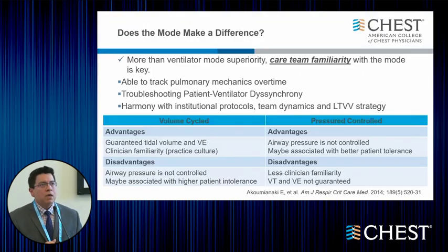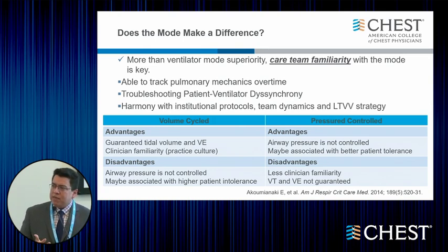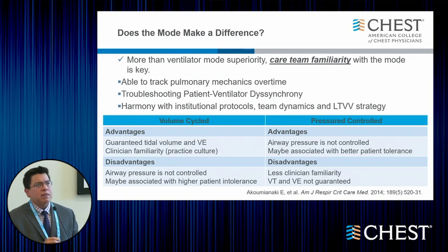volume. And when we talk about modes and what evidence-based medicine says about superiority of a mode, the answer is there's no superior mode. The type of mode that could be determined to be best for patients depends on the culture and critical care team familiarity with the mode. There are some advantages.